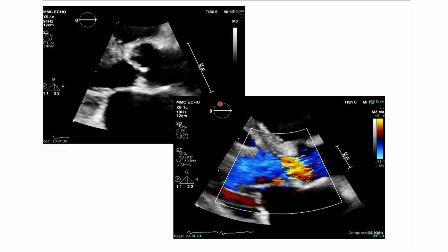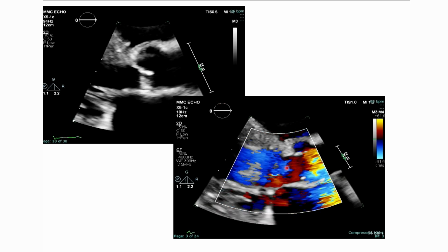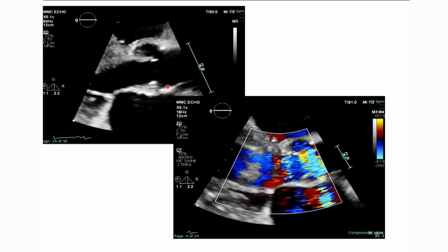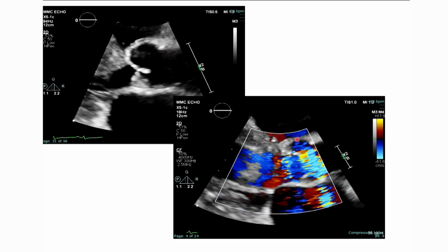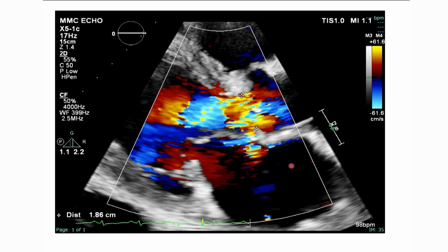We put color on. That looks normal, right? I don't think so. We kind of look at the valve, like what's going on here? A little thickened, but the aortic root is not very dilated. But if we look at this regurgitation, essentially, they attempted to measure the vena contracta. It looks like it's filling the entire LV outflow. That's a lot. That is a lot.